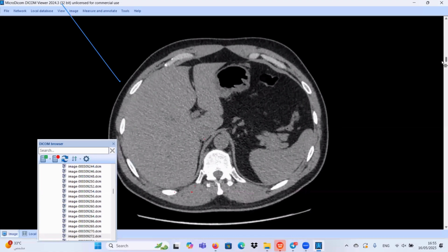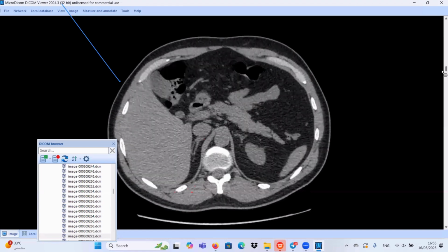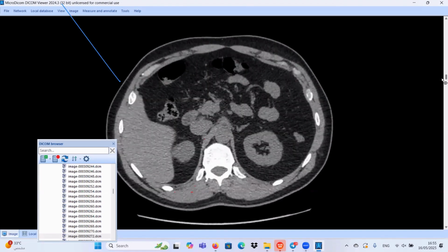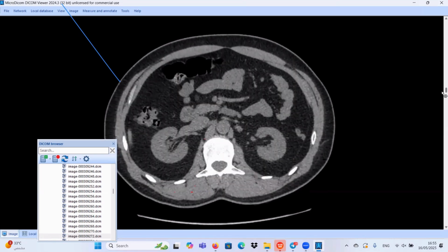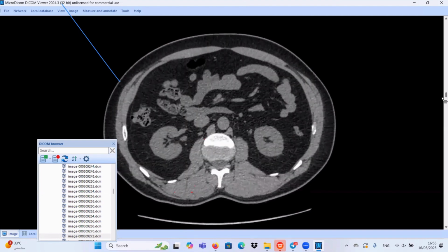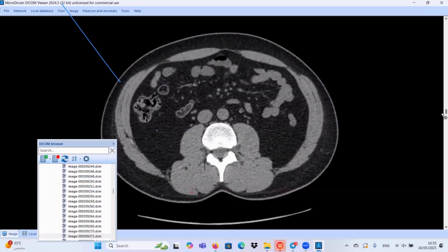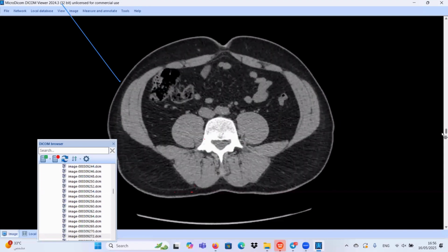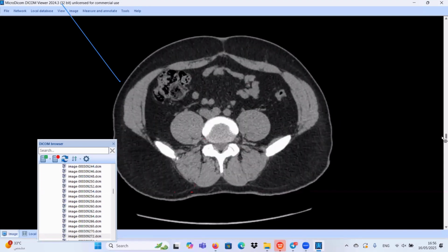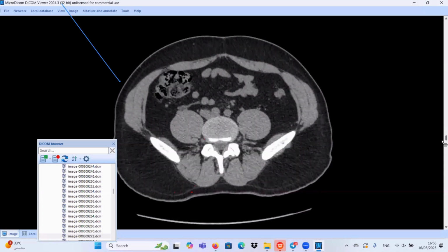Okay. Go to the liver. Liver appearing normal. Gallbladder also appearing normal. Pancreas appearing normal. Spleen appearing normal. Both kidneys also appearing normal. Aorta appearing normal and IVC. I couldn't see evidence of hernia in the abdominal wall.